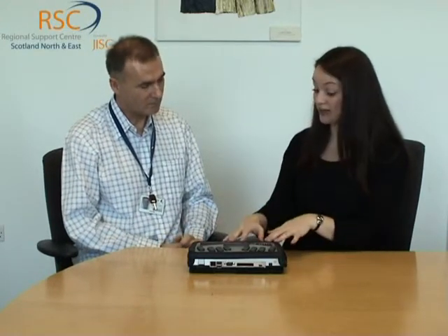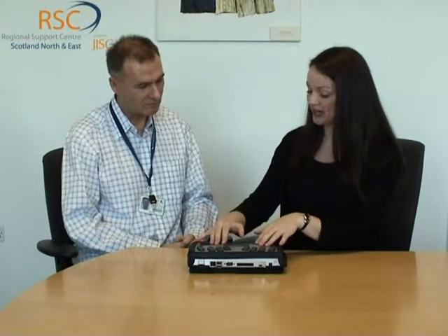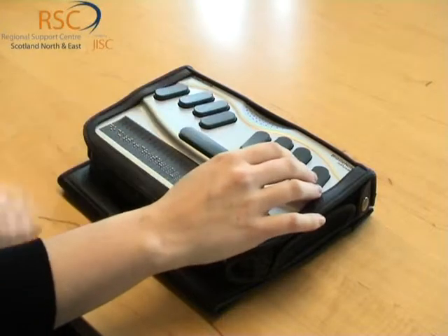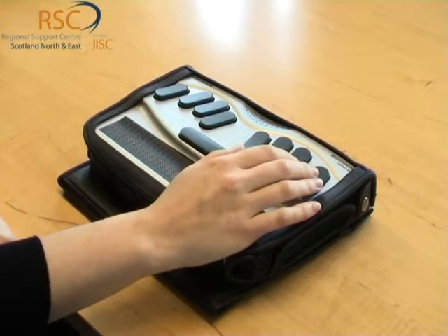This is the HumanWare Braille notetaker Lucy, for taking notes and reading them back. The notetakers' primary purpose is note-taking, and this particular unit has the Perkins-style keyboard for inputting — that's the real keyboard. You can actually get the same unit with a QWERTY keyboard as well.